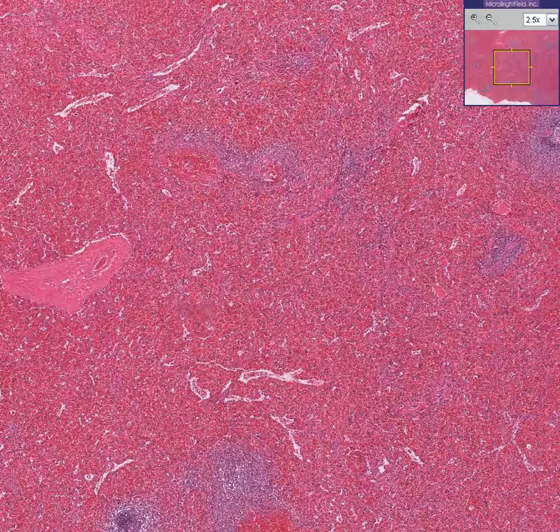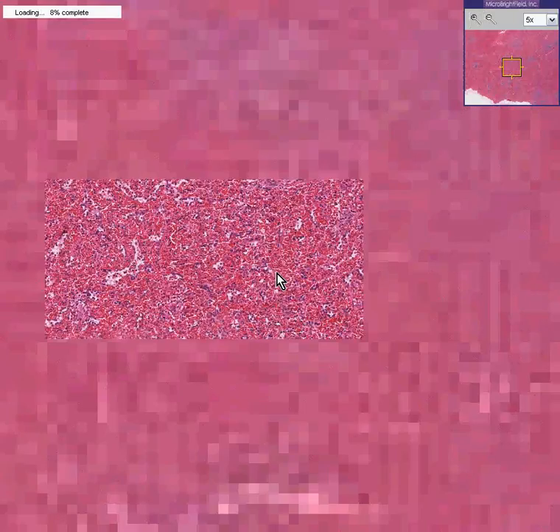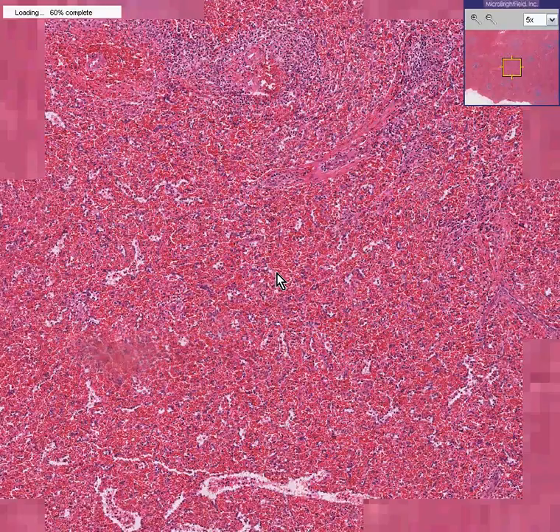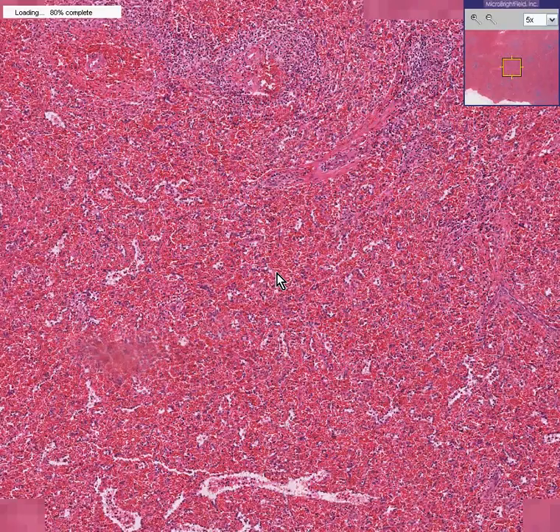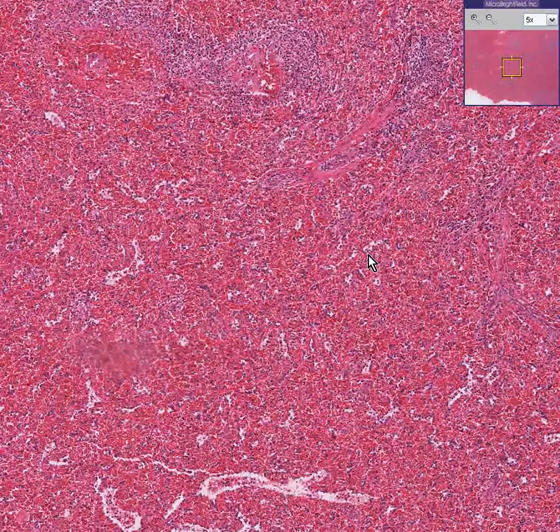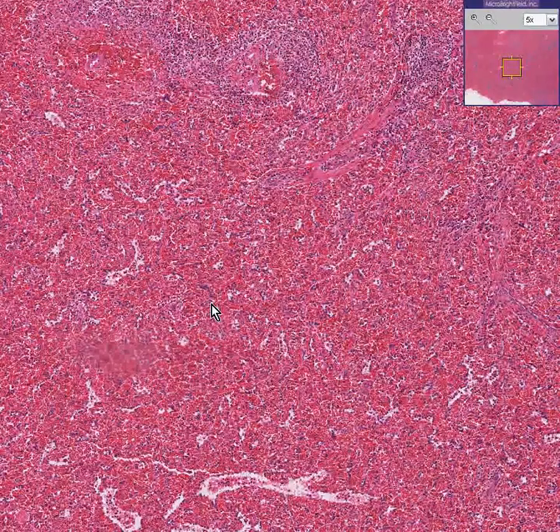And even though we are not going to go into the biology, pathology and genetics behind it, like all other hemolytic diseases, the cells are not being produced effectively, and therefore they are being destroyed quickly. Therefore there's an overactivity of the red pulp that results in the red pulp being more predominant than the white, as well as the spleen itself being larger.